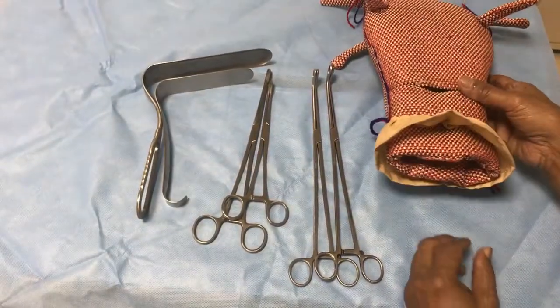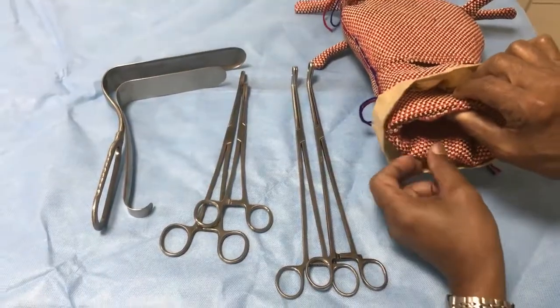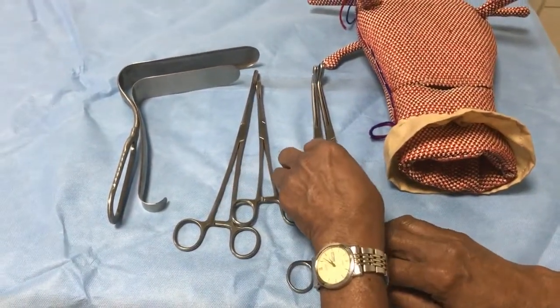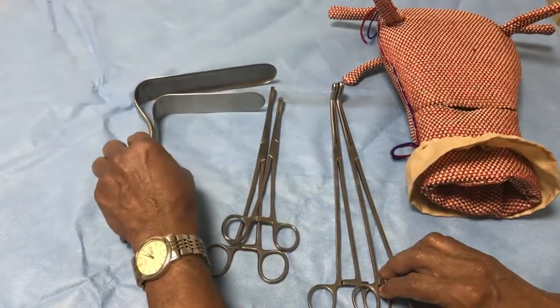This is a model of the uterus, with this part representing the vagina and these representing the lips of the cervix. These are the two clamps that we need, along with two sponge holders and these retractors.